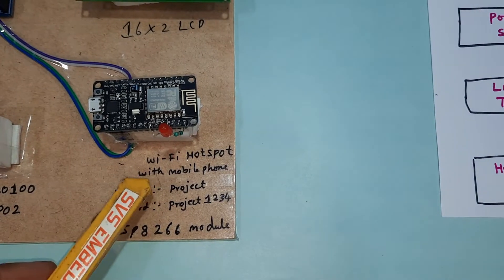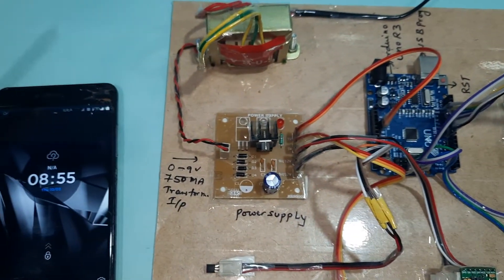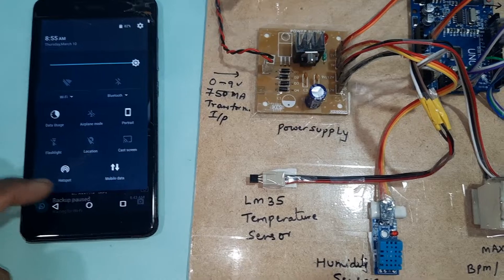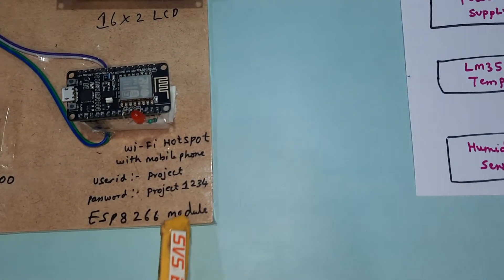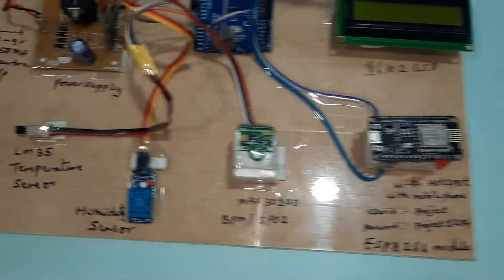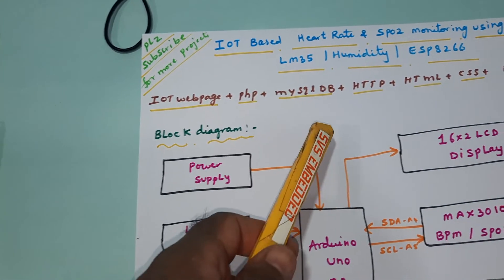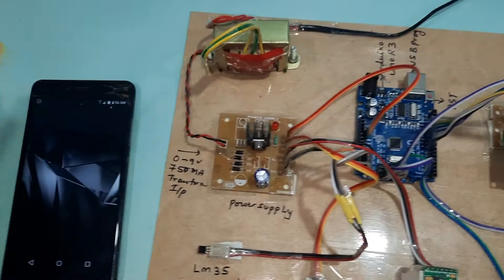We are using a mobile hotspot — the hotspot SSID password is all lowercase: 'project1234'. The IoT system uses a PHP webpage, MySQL database, HTTP protocol, and supports email alerts for abnormal readings.